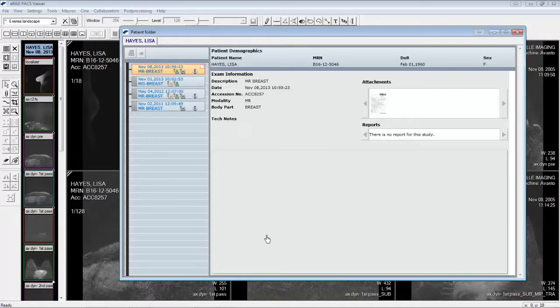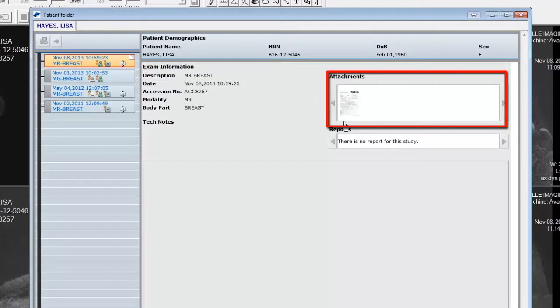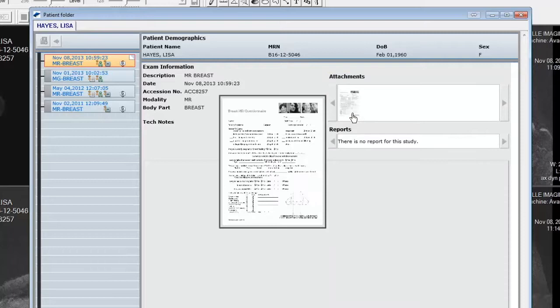Prior studies are displayed in a timeline style list in a newest to oldest sort order. Scanned documents can be found in this area as small thumbnails. Position the mouse over the attachment icon to display a larger view of the attachment. Left mouse click on the thumbnail to add it to the image area.